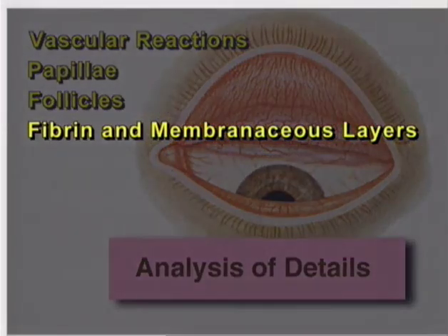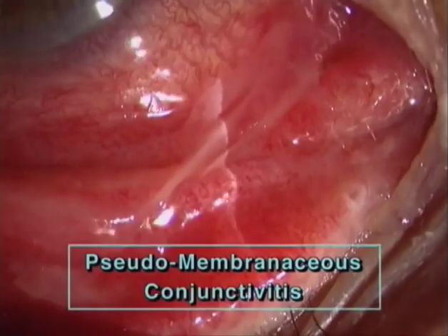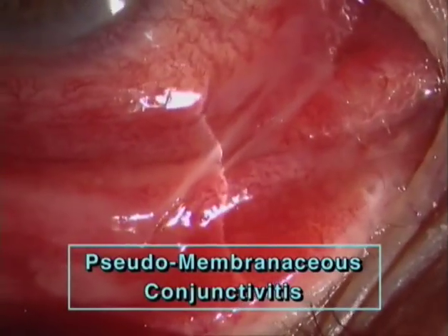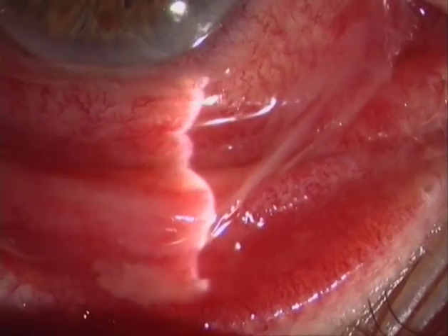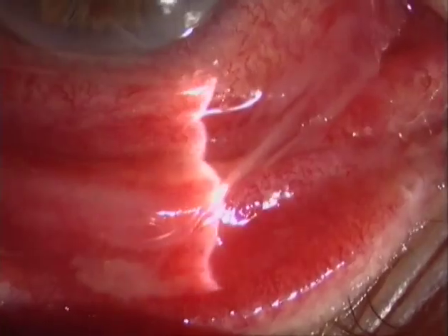Fibrinous and membranaceous layers. Such layers are often hidden causes for problems related to the cornea. This is why their diagnosis is important. In this case, the thick membranaceous layers are easy to recognize, especially where partially detached, as here in the lower lid.